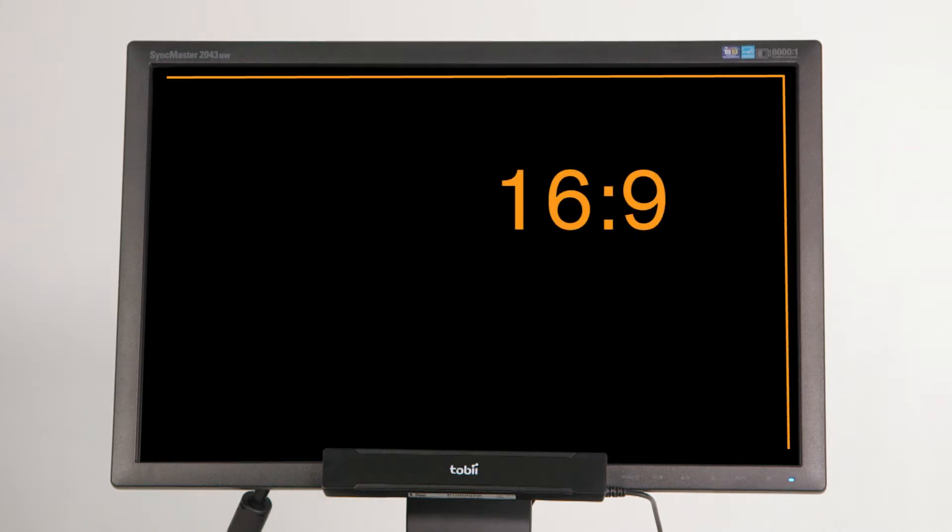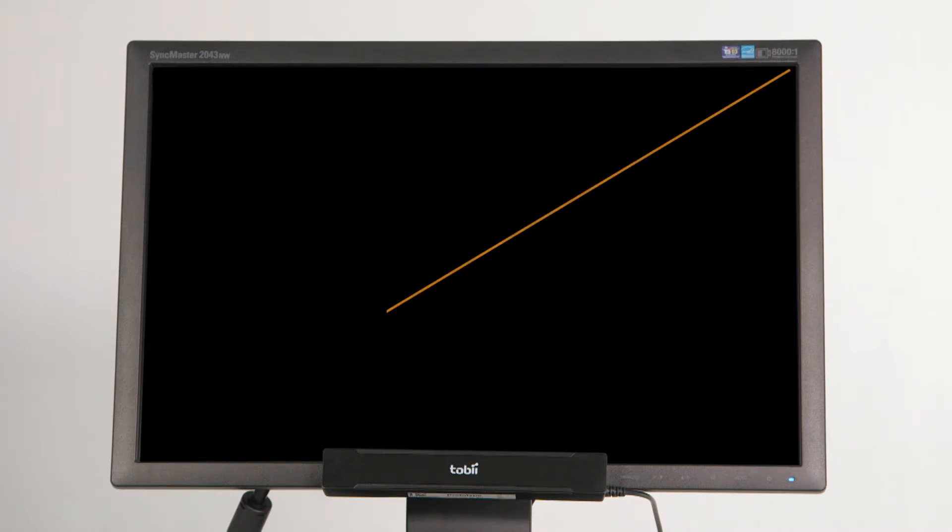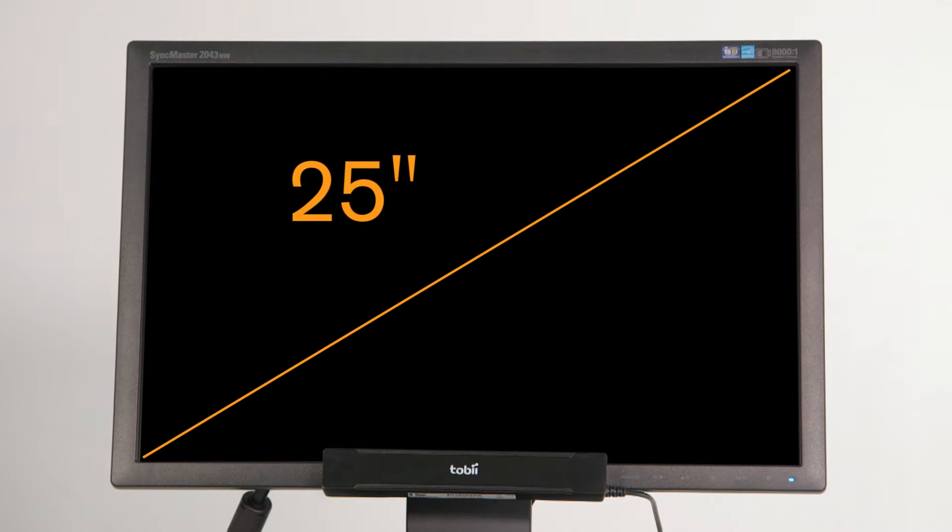If correctly mounted, the Tobii X2 Compact Edition eye tracker can be used on screens with an aspect ratio of 16 to 9 and a diameter of up to about 25 inches.